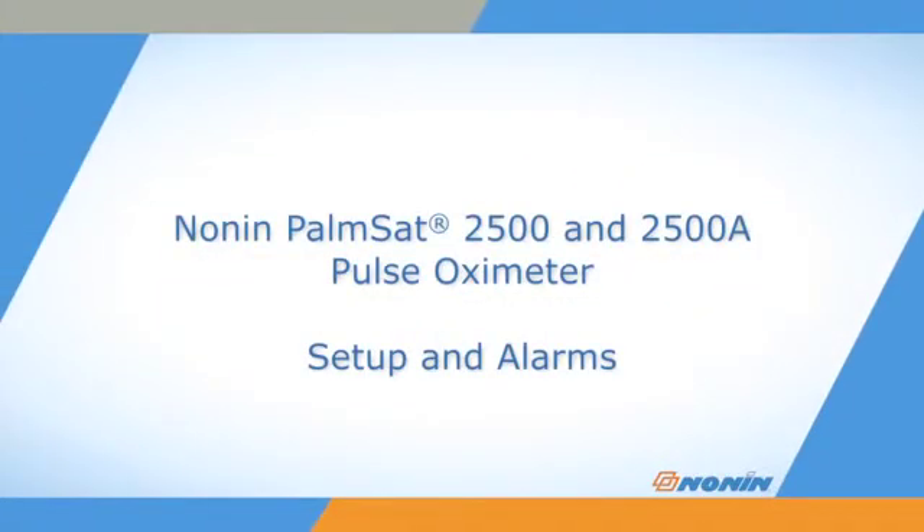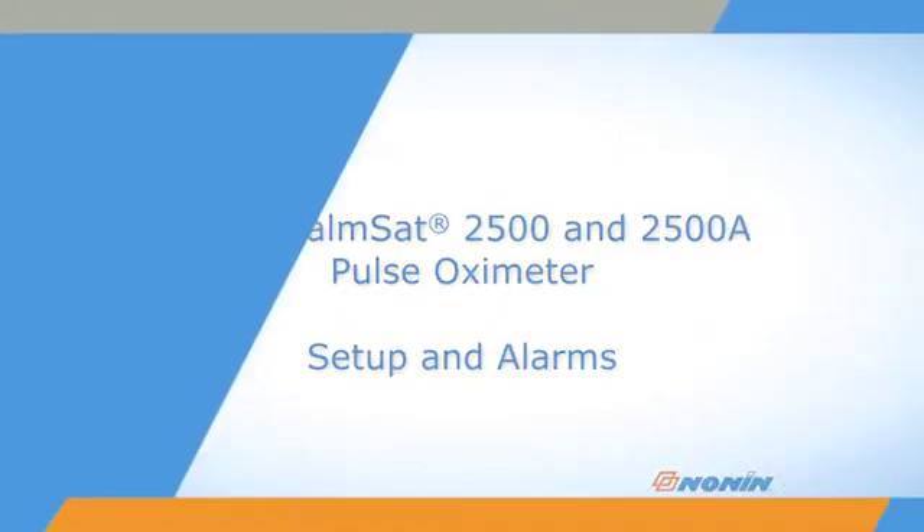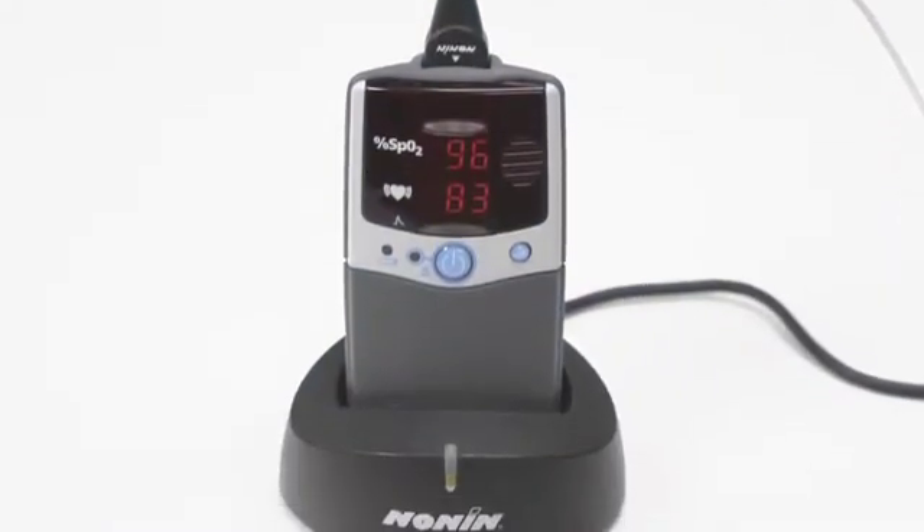This short video shows how to set up and adjust settings on the Nonin PalmSat Model 2500 and 2500A Pulse Oximeters.